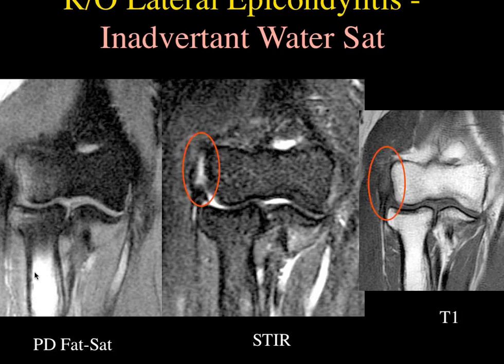There's also an effect that has to do with the transmit coil. If there's any inhomogeneity in the B naught or in the transmit coil, that can also affect the amount of energy which your suppression pulse puts into the tissues in a different location. So there are a number of different things that can cause inhomogeneities in the object. But in the coronal or sagittal plane, generally there shouldn't be any difference.